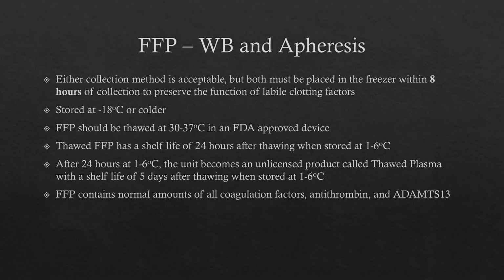Fresh frozen plasma. So whether it's derived from whole blood or apheresis, basically it's going to be treated, and we can expect the same for FFP, regardless of the collection method. Main thing is that FFP must go in the freezer within 8 hours of collection. And that's to preserve the function of some of the labile clotting factors.